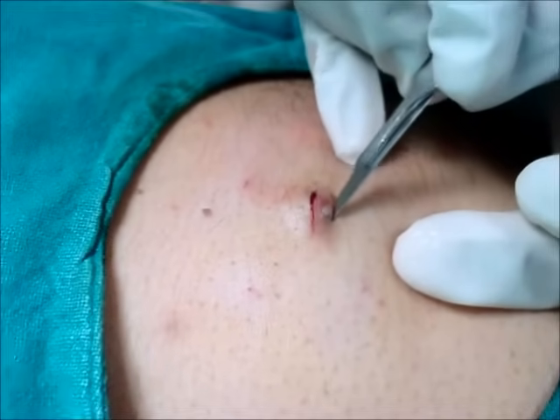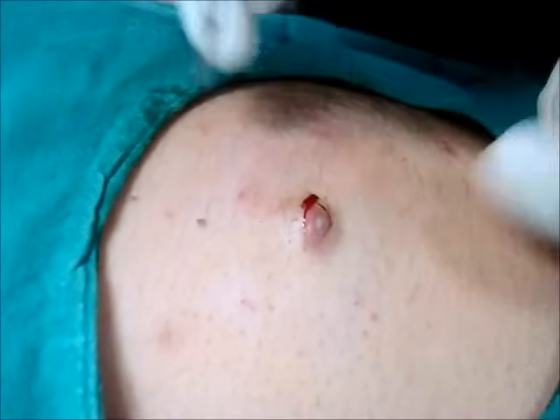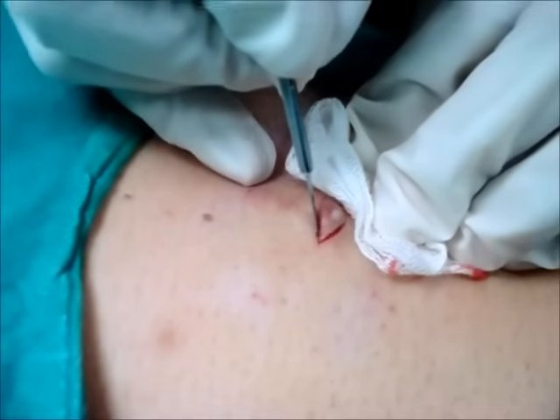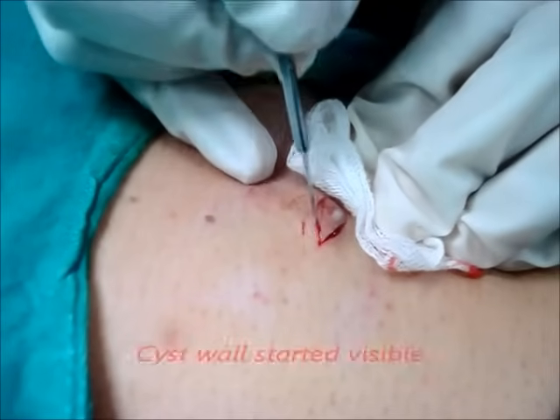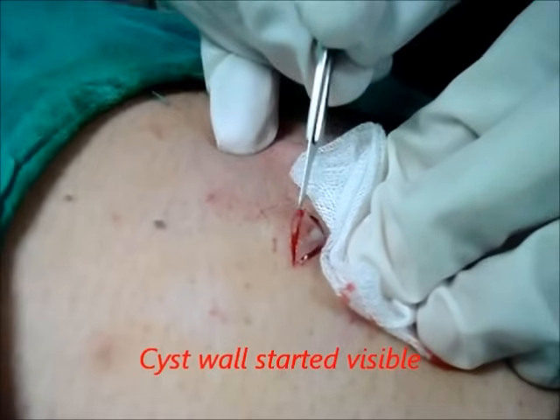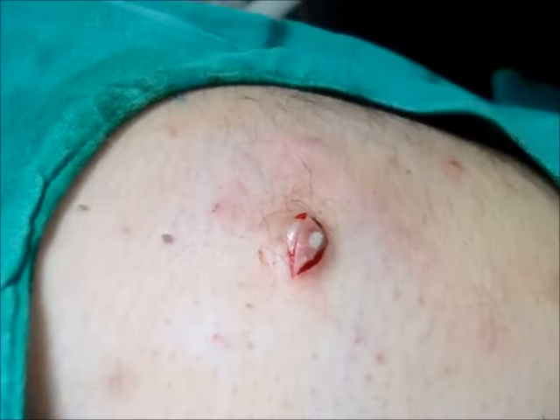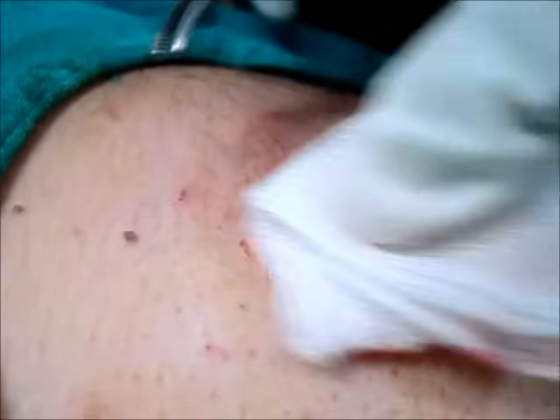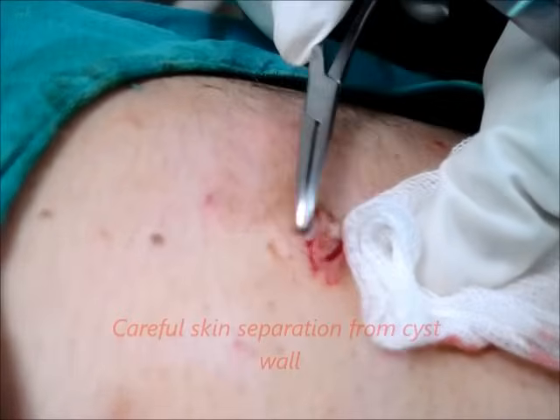I use local anesthesia — 2% lidocaine with adrenaline — and give a field block. After the area gets anesthetized, I use a number 15 blade and give an elliptical incision which includes the skin and part of the punctum. Now you can see the cyst wall is visible.